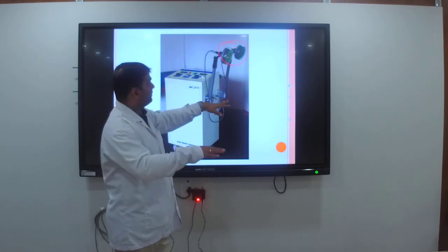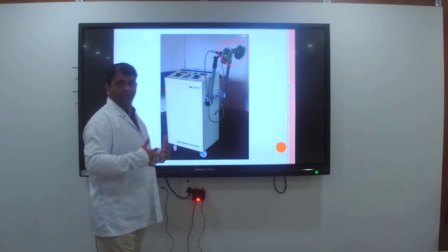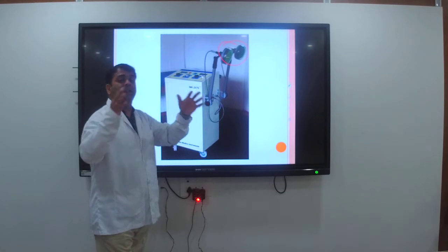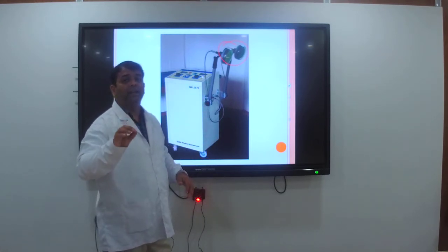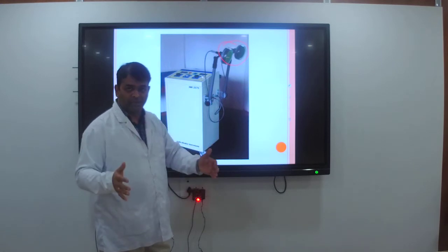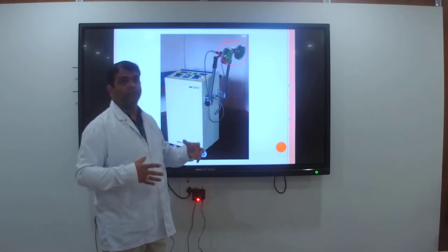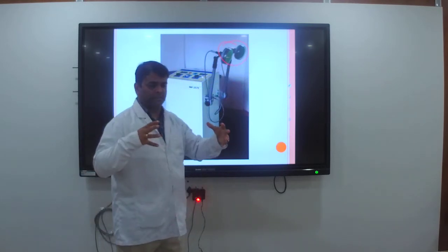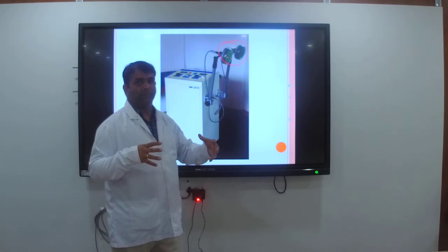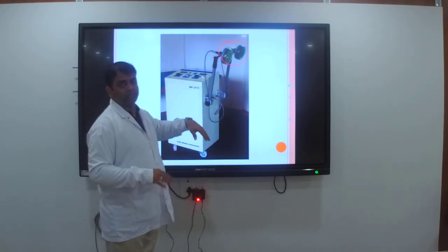The patient will be sitting in a chair comfortably with an upright back. And the most important thing is you have to apply a towel over the patient's treatment area, and then you have to apply the electrodes with an equal distance on both sides. That is the preparation of the machine and the patient.